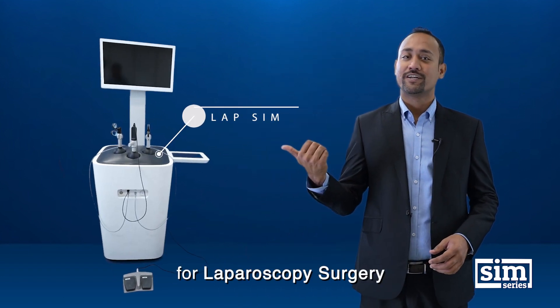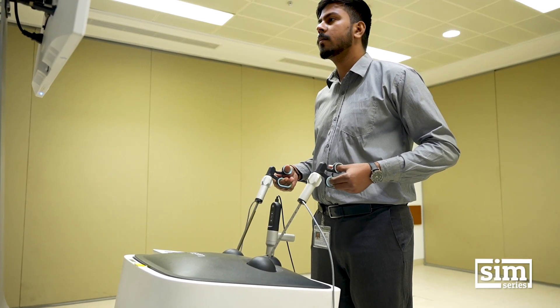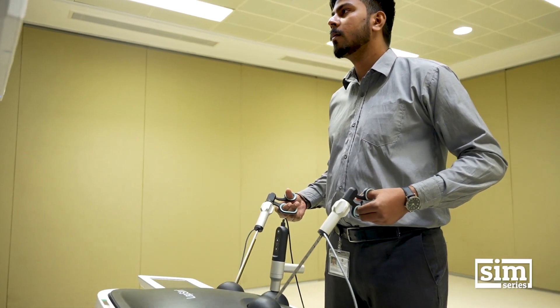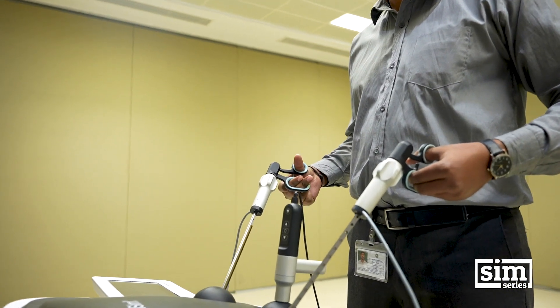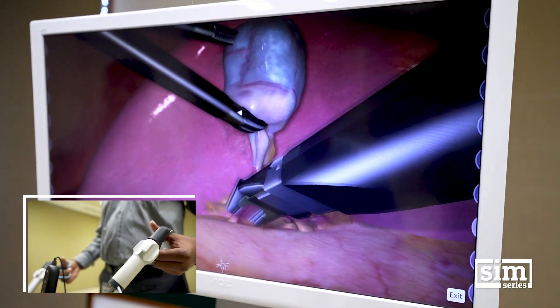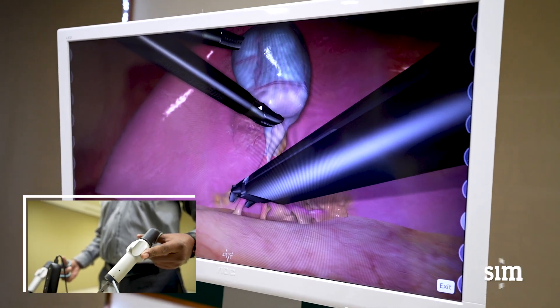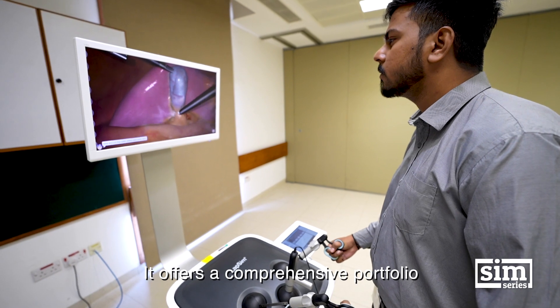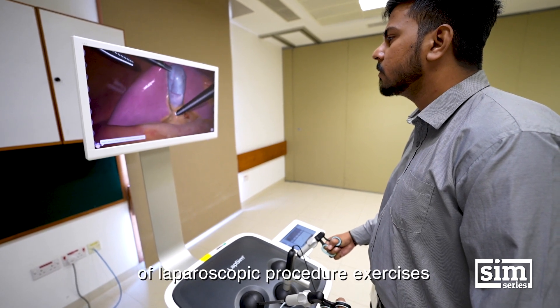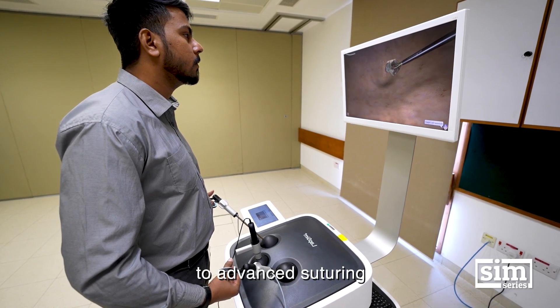LabSim is a VR-based simulator for laparoscopy surgery. It offers a comprehensive portfolio of laparoscopic procedure exercises that range from basic navigation to advanced suturing.